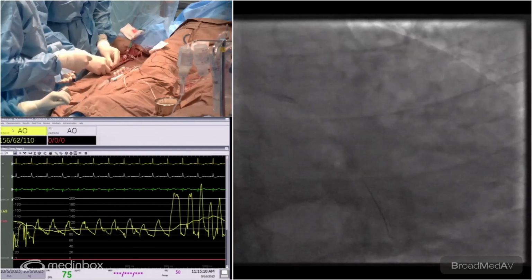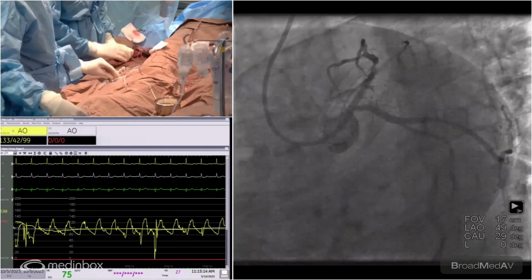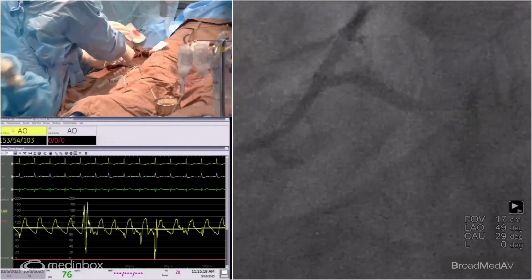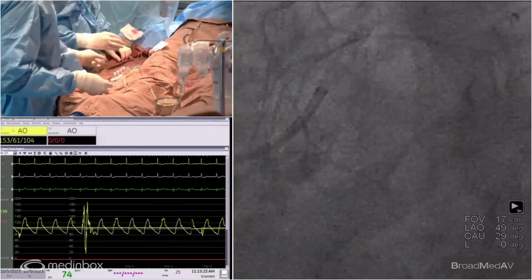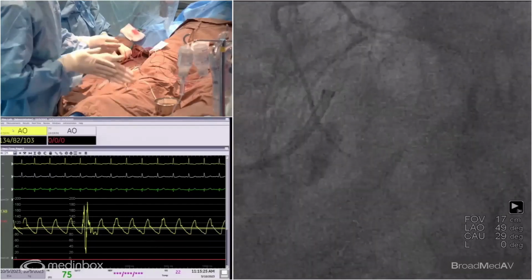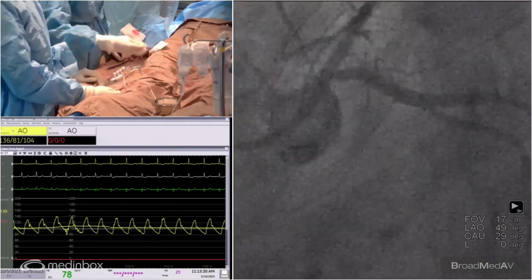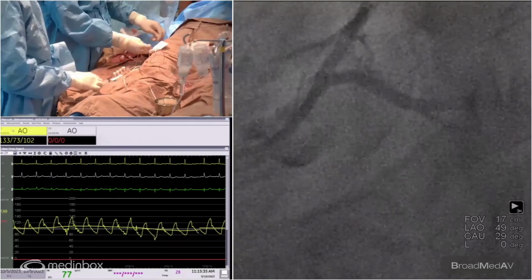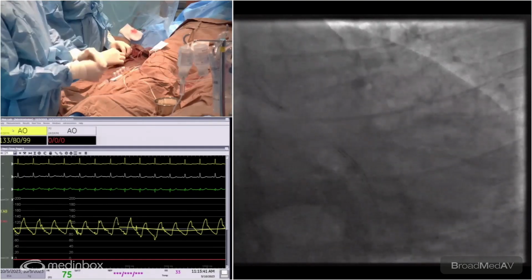Can we run that last picture on the circ, please, before we go in? So there are two issues. One is the stent was at the ostium, just about at the ostium. So we could be either through a strut of the circ, or it could be that the previously deployed balloon has lost its profile. And so we're going to use a smaller balloon and see if it tracks through. Otherwise, we'll bring the wire back and then recross and see how it happens.